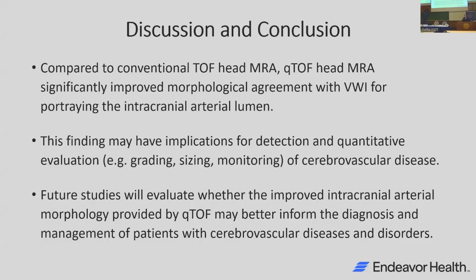The initial impression from my clinical collaborators is just their feeling that with this quantitative time of flight technique, the vessels are more clearly displayed, or things just look more real to them. But we didn't really have proof, and this was our initial foray at trying to see if we get better correspondence to a more anatomic exam, which was what we used the dark blood MRA exam for. But definitely, absolutely, we should compare that in the future, and we hope to do so. Thanks for the question.